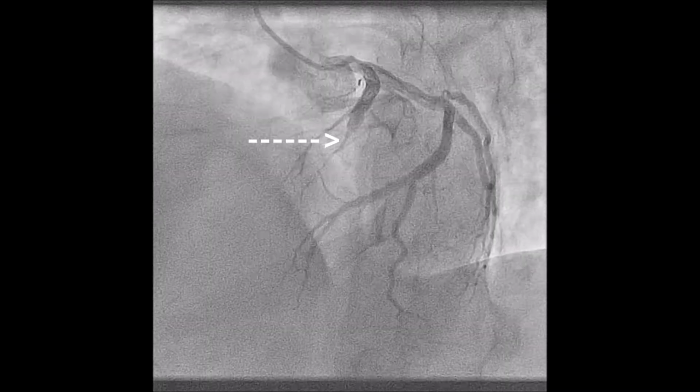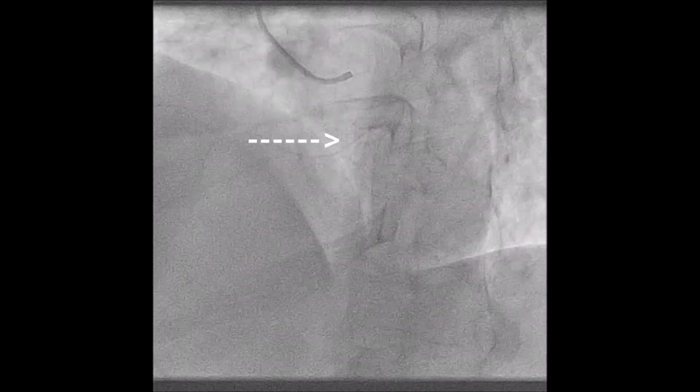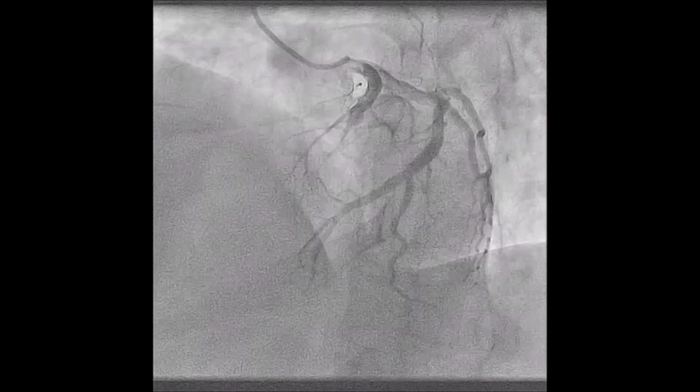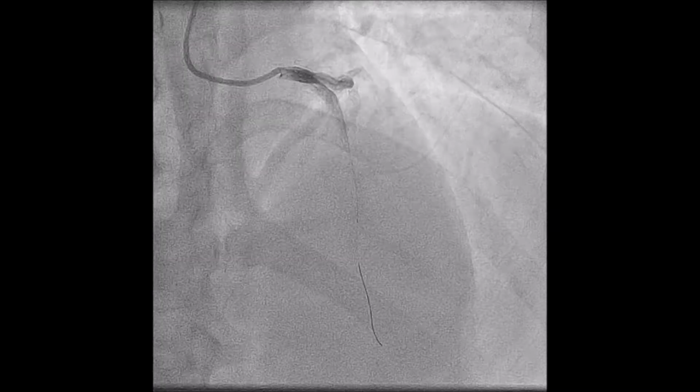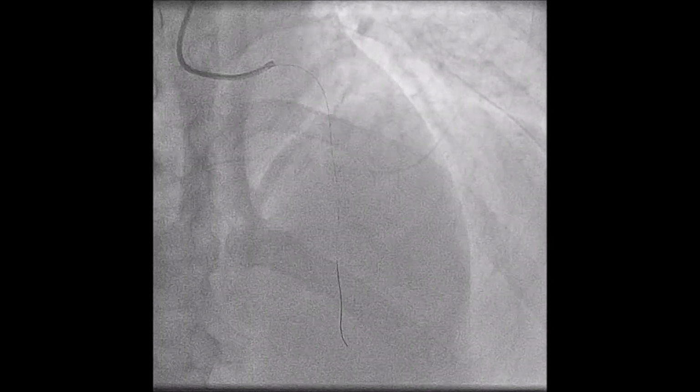For its part, and regarding the anterior descending artery, it is clear that it is obstructed at its proximal level, which explains the electrocardiographic changes previously described. Now we know where the obstruction is and we only need to treat it.